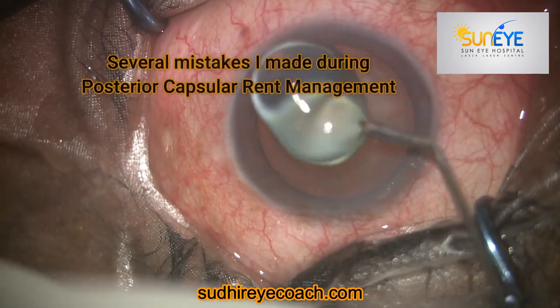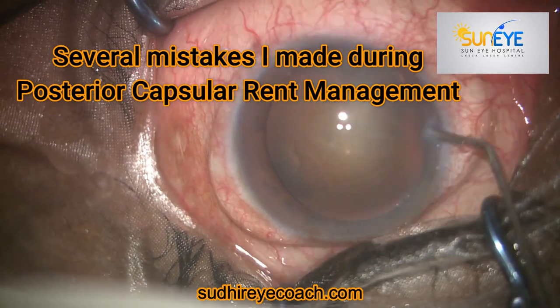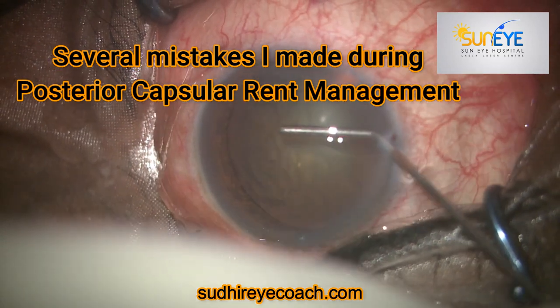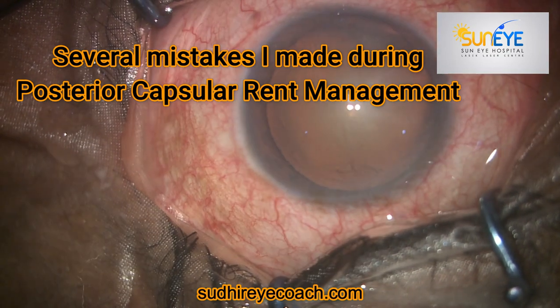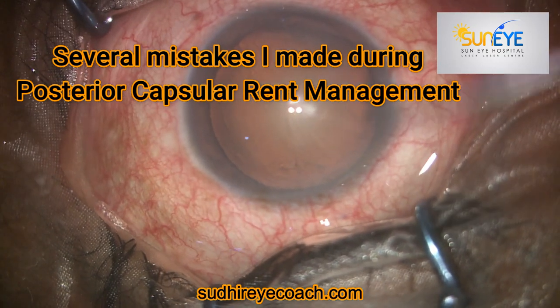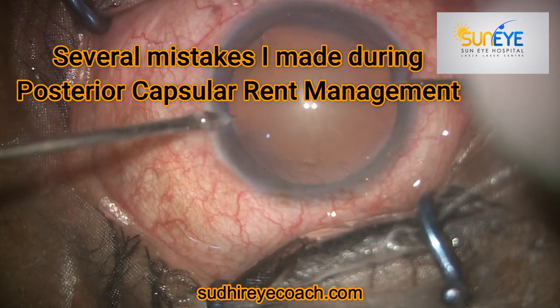Hello everyone, today I'll be showing a video of several mistakes which I made during posterior capsular rent management. As you all know, for cataract surgery, PCR or posterior capsular rent is one of the commonest complications to encounter, and if you take a few important tips then definitely you can come out safely without creating much of a problem.